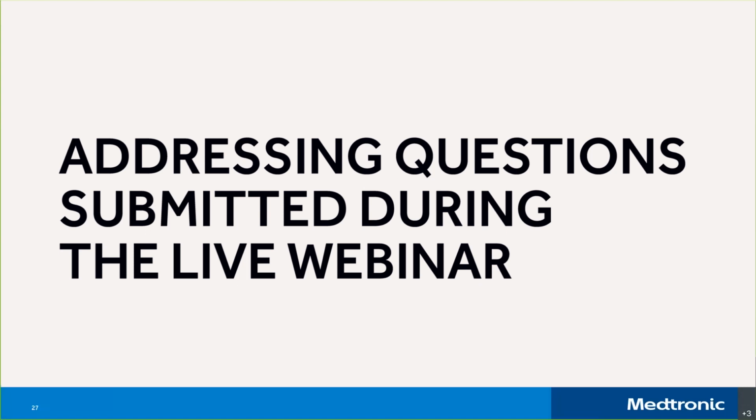Okay, so if you're not using the Contour NextLink meter, it's important that you manually enter those blood glucose readings into the pump so your physician can see all of your readings. Sometimes what happens is we enter the glucose readings when you're high and you're giving a correction bolus or a mealtime dose, but we don't always enter those good numbers or numbers that are low, and those are important numbers for your physician to see as well. Having said that, I want to add to that, it's also important to add your carbs and enter those into the bolus wizard. Again, this gives you and your provider a lot more data to help you make the best therapy decisions and help you get the best blood sugar control.